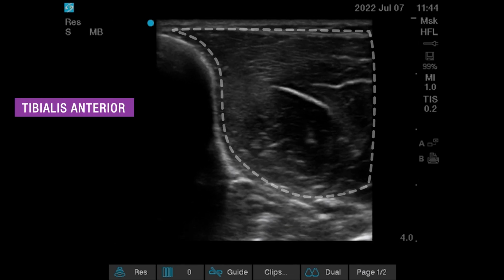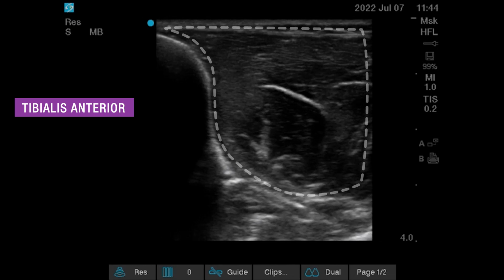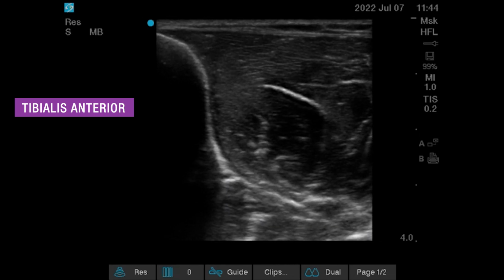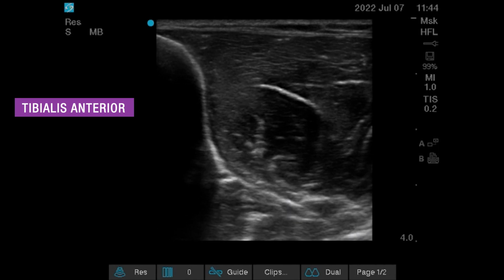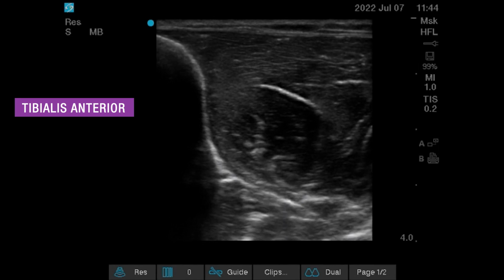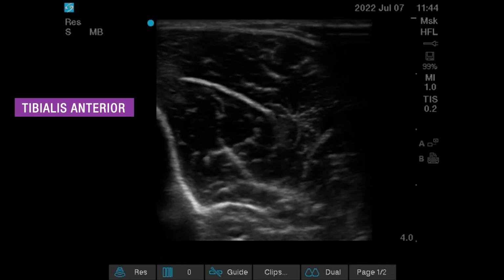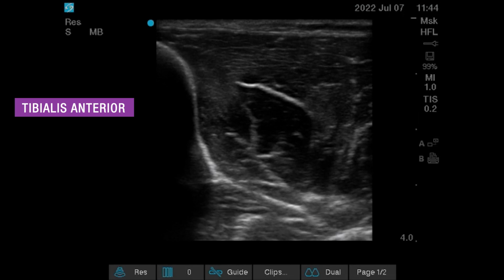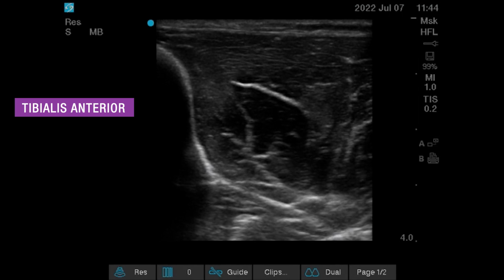We can identify this muscle in two ways. Firstly, by the position of the probe on the leg, we know that it must be tibialis anterior. However, if we were in any doubt, we could ask the patient to dorsiflex his foot. As you can see, this has contracted the muscle, and we know that tibialis anterior dorsiflexes the foot.